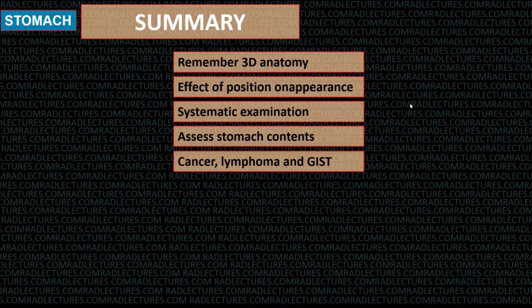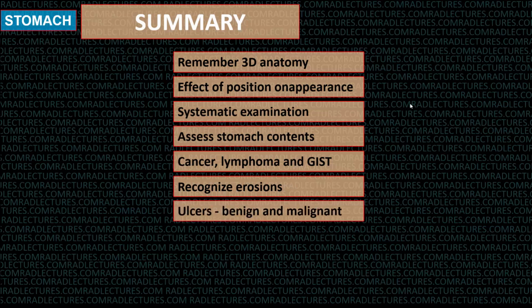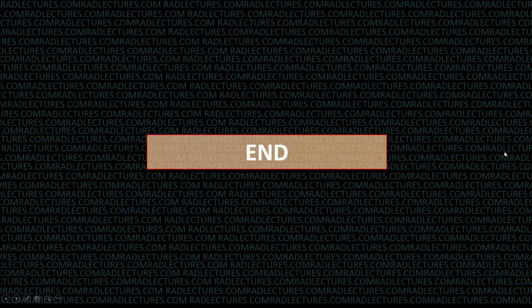The commonest tumors of the stomach are cancer, lymphoma, and GIST. I want you to be able to recognize erosive gastritis and differentiate between benign and malignant ulcers. That brings us to the end.